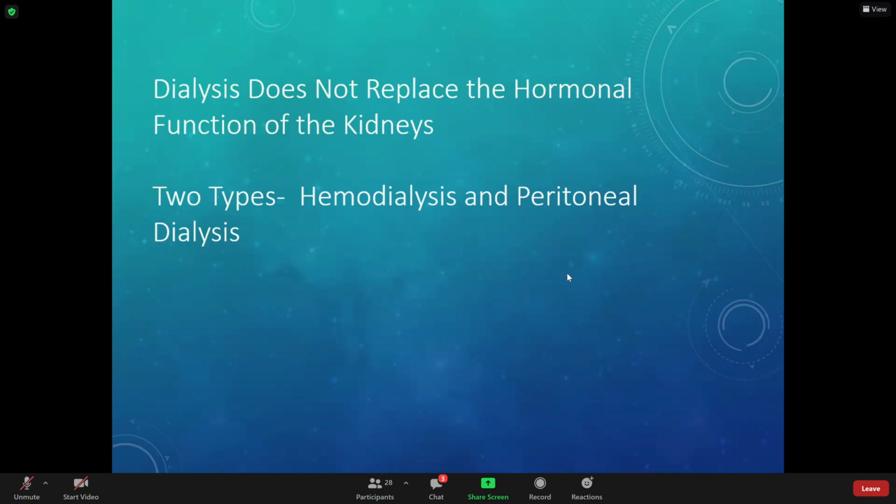One of the complications that happens when they're on the dialysis machine is we take out too much fluid volume with the machine too quickly. And the patient's blood pressure drops. And sometimes patients actually code on a dialysis machine. So while you think, okay, that seems like a pretty simple job, it really is not as simple as it seems, because you're removing a lot of fluid in a period of 3 or 4 hours. You have to be careful. So the patient is closely monitored for blood pressure, heart rate, level of consciousness, the entire time they're on that machine. And I've had patients where, when I'm working at Kent or Christiana, they call code blue on dialysis. The reason why, probably too much volume is removed too quickly. The patient can't tolerate the decrease in their blood pressure.